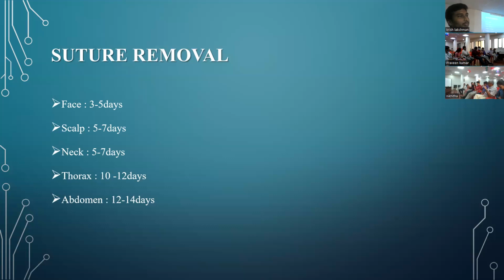That's a different matter; you are talking about an infected wound. Then we also take out two sutures, these gaps. That's a different issue. Talking about an uninfected wound: if you are unsure whether the normal tissue strength is adequate to hold it together or not, don't take any of them out. Leave it another week. What's the big deal? Wait, you may get a worse scar, it doesn't matter. It's much better than taking it out prematurely and everything giving way.